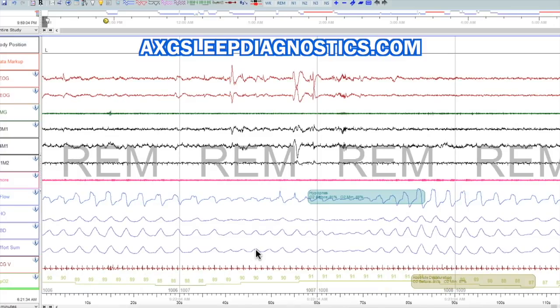Okay, this is a great example of a hypopnea. So you can see they're in REM sleep. Now this doesn't look like much, does it? We see a lot of these in our sleep, but we also see no jiggy jaggy. See how nice and uniform these are? These are smooth. It actually looks the same as that, which kind of looks the same as that. The only thing is this one had an oxygen saturation drop of 4% or more. And without an arousal, that qualifies as a hypopnea. But do we need to really worry about that? I would argue no, because there's no arousal here.